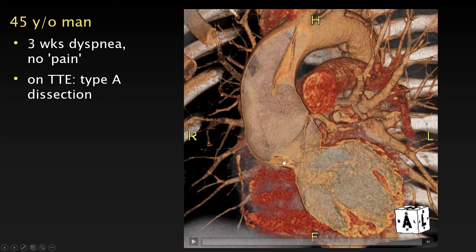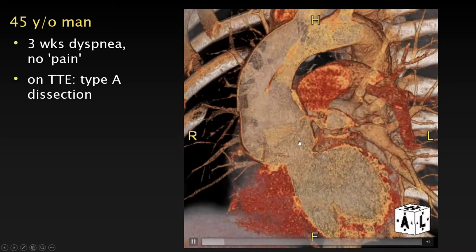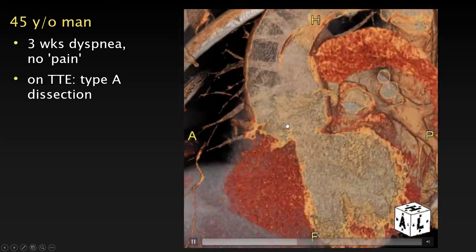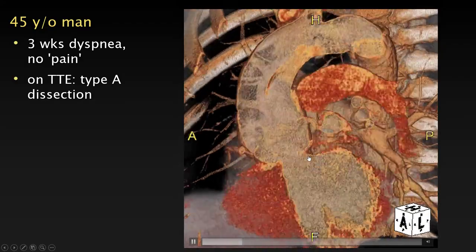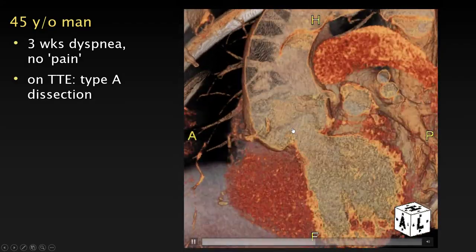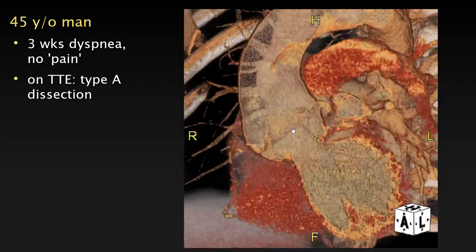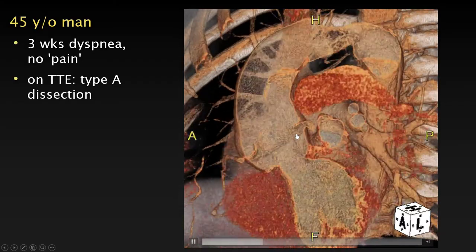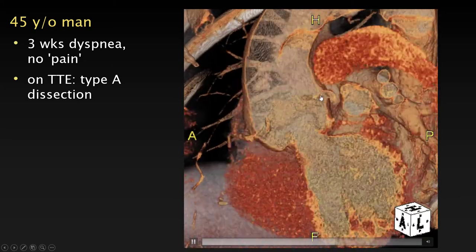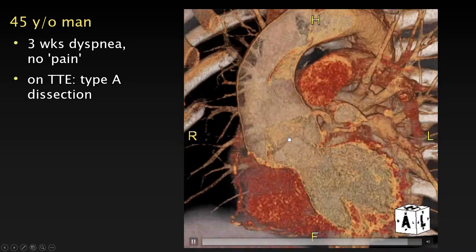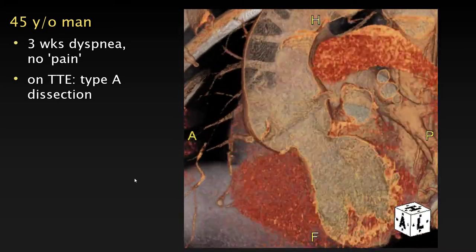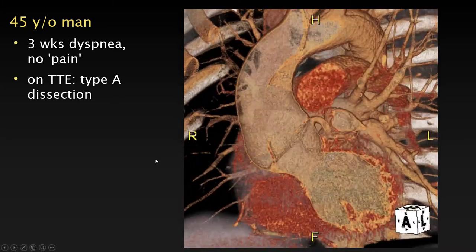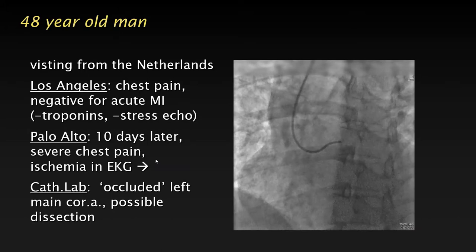It's even better seen in 4D because you can see that the large flap moving up and down is truly a dissection flap — the tissue that connects to the rest of the dissection — and not the valve, because the aortic valve is clearly visible separately. While you can probably make the diagnosis without 4D, it also allows you to tell the surgeon exactly where the dissection flap begins relative to the left main and right coronary arteries, helping plan whether to repair only the ascending aorta or also the root and valve.